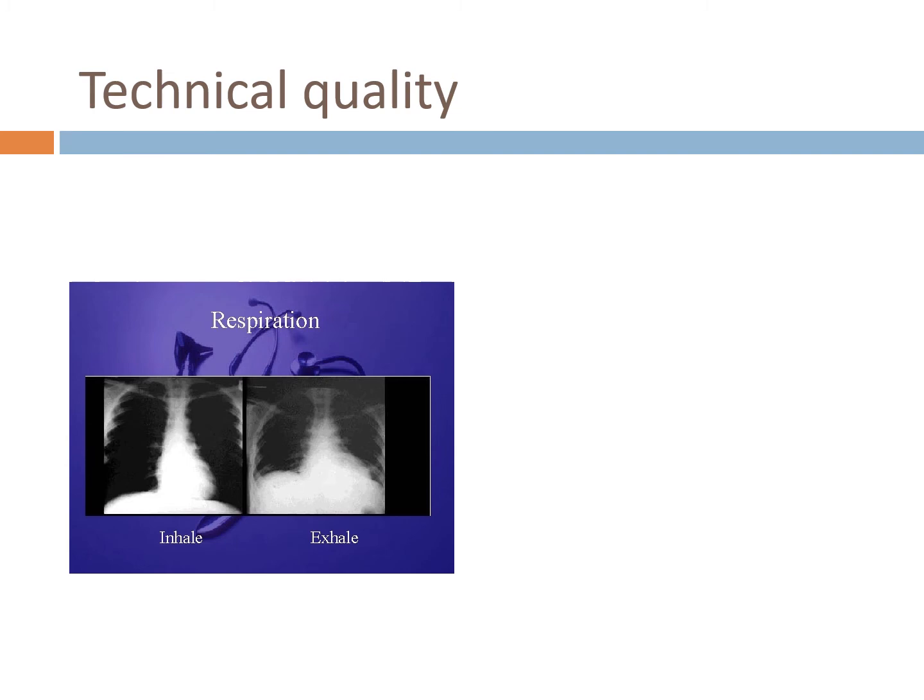But anyway, make sure you put your lead on, and then the radiology tech might ask you to give a good squeeze, and then they'll shoot the film. So you're actually responsible for getting that good breath in, because if you have a poor inspiration, your heart is going to look larger than it truly is. So it's important.